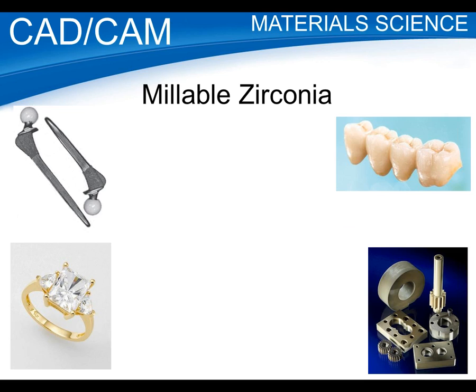And I want to emphasize again that zirconia is very strong. Though if you look at this, it's not necessarily all that translucent and maybe not all that natural looking. This is a case of a PFM. Now, if you use zirconia as your substrate and apply porcelain on top, again, you can get beautiful restorations. Though, again, zirconia by itself is a little more opaque, not quite as translucent as you can get with a good porcelain. But again, this stuff is strong.